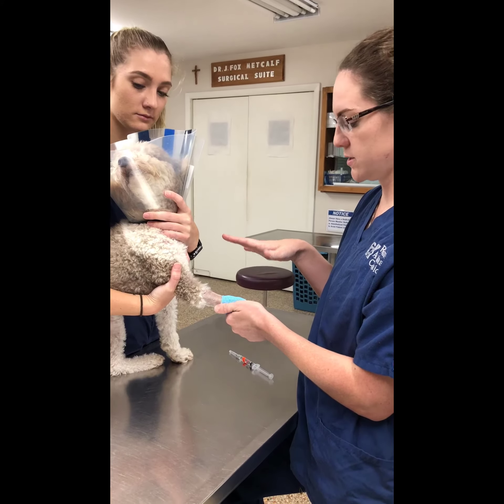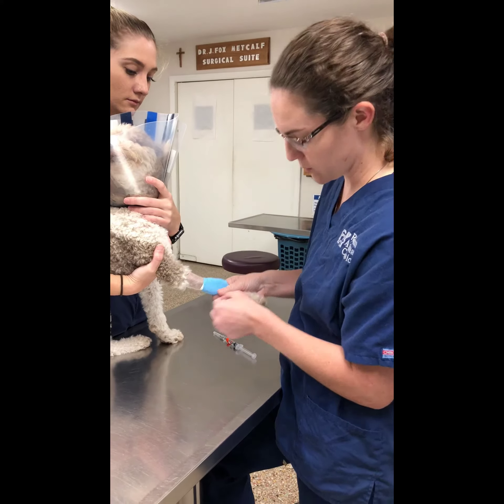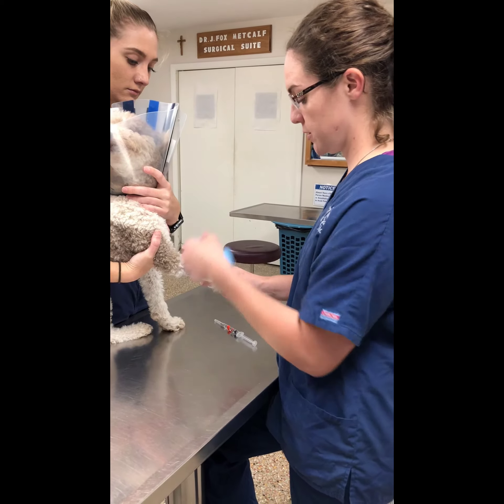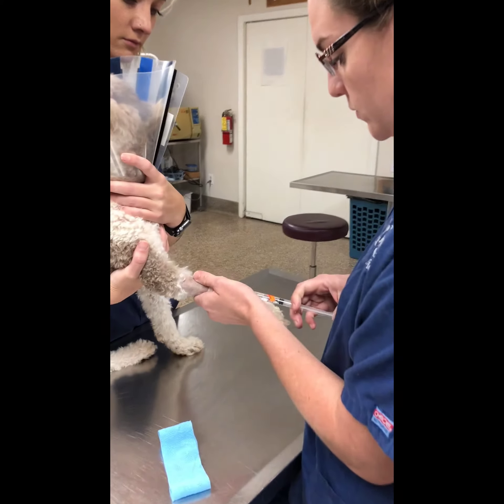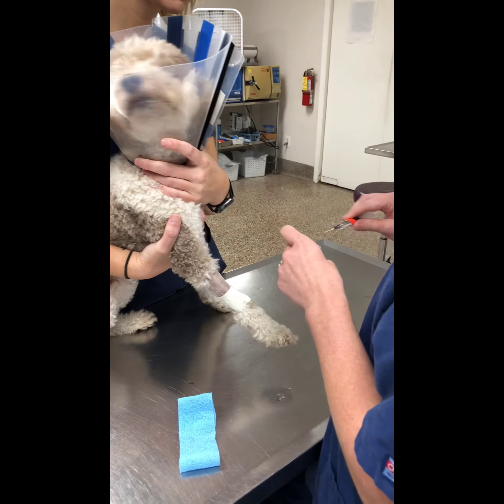I'm going to be checking this one's catheter. I've already watched the instructional video, so I'm going to remove the bandage. We want to make sure that we flush a catheter every three to four hours to ensure that it's still in, which it is — it's flowing well, and I can actually feel it in the vein.